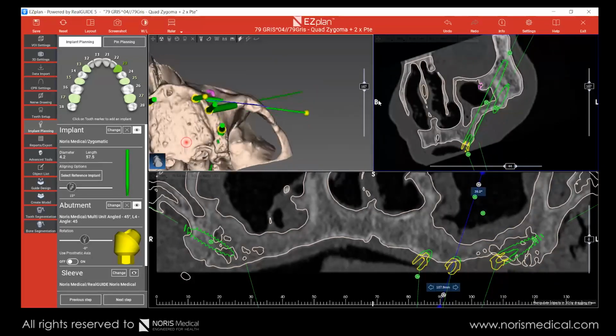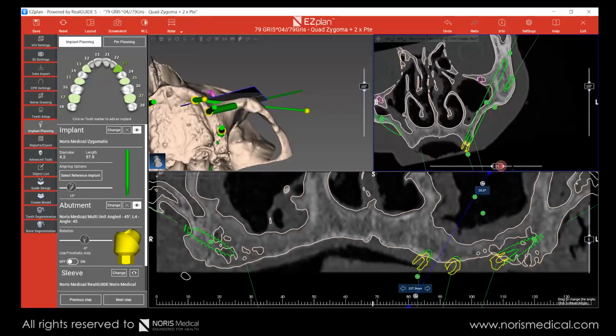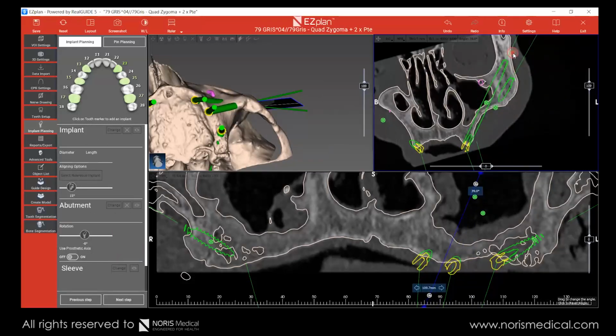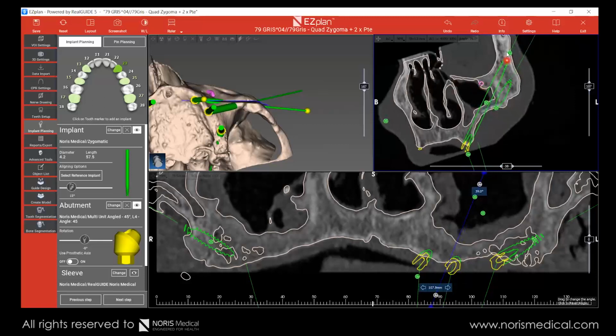Check the distance. The way I do it, I just make a full rotation to see the minimum point. At the minimum point, I will just move it away a little bit, to the distance that I want it to be. The distance like that. Okay.